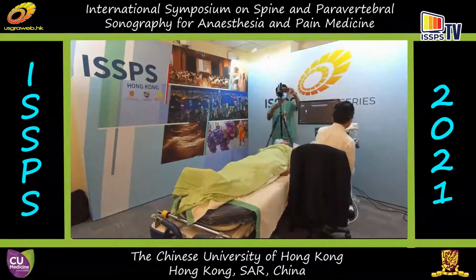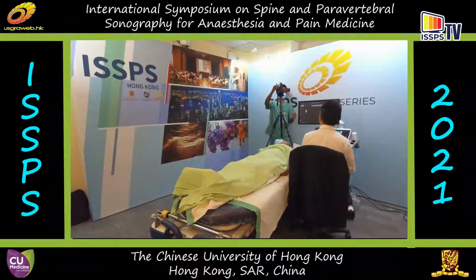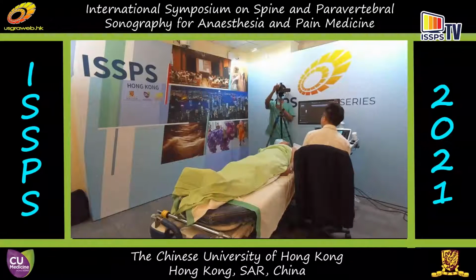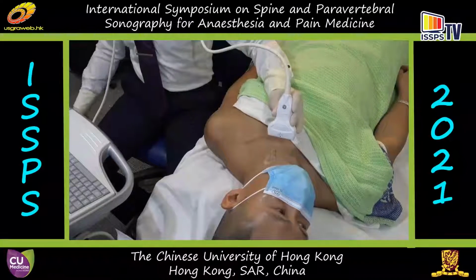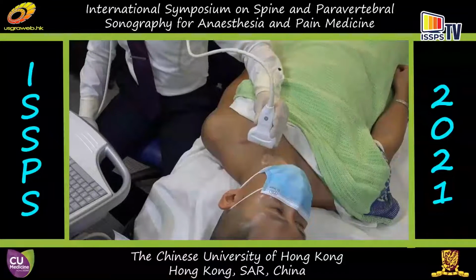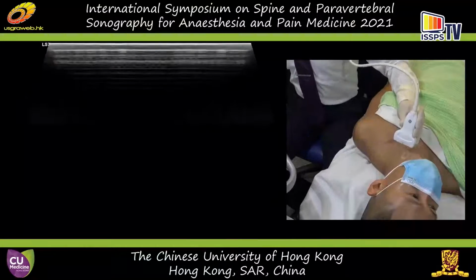We have an exciting half an hour, and I've already introduced to you Dr. Stanley Lam. He's from Hong Kong, a very well-known musculoskeletal therapist, a doctor par excellence, and now he's going to demonstrate to us all the ultrasound imaging of the cervical, lumbar, paravertebral, etc. within the half an hour period that he has. So, Stanley, take it away.